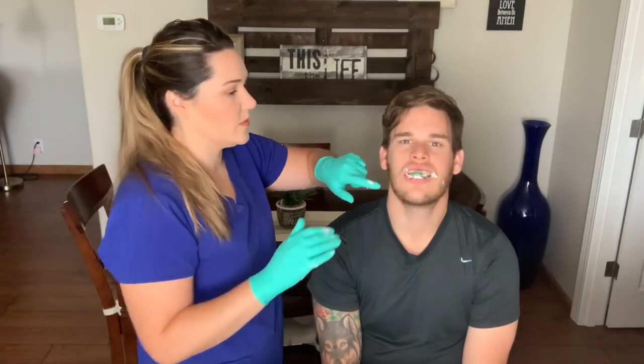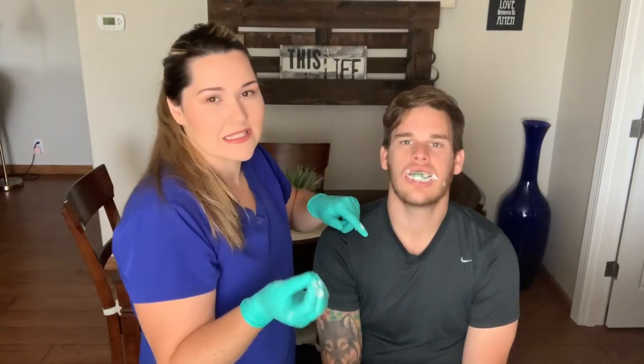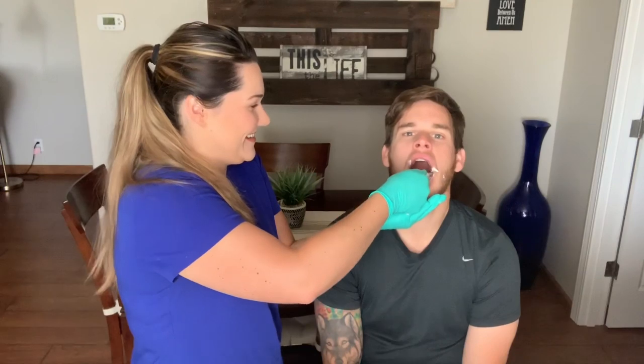While it's setting up, I'm cleaning out my mixing bowl — you can do this or have an extra bowl ready. I'm going to check if it's time to come out. The color has changed to white, but I always tell the patient to stay biting while I just check the alginate. When I feel it, it's very silicone-like — you know it's set because it's not sticky anymore. Go ahead and open.